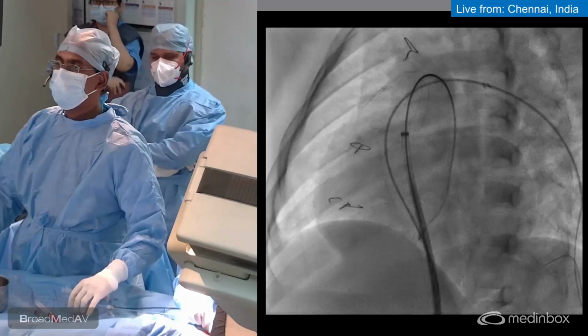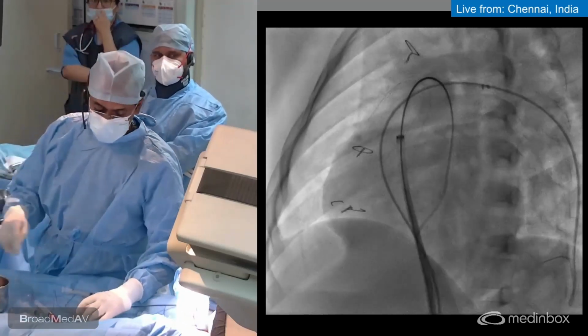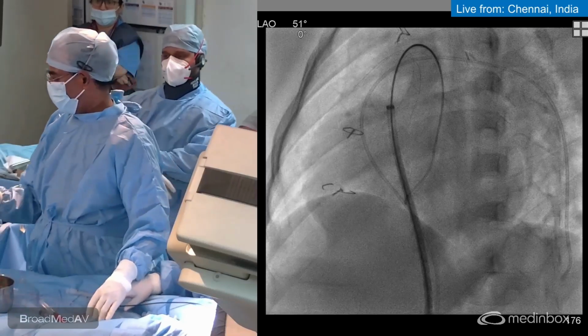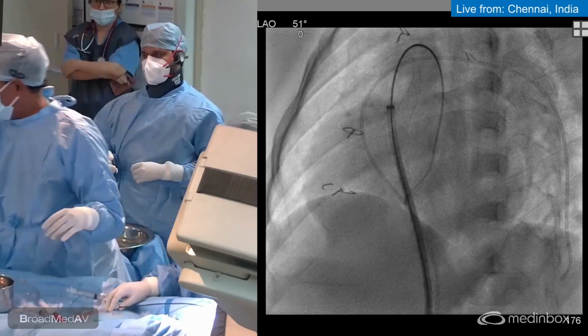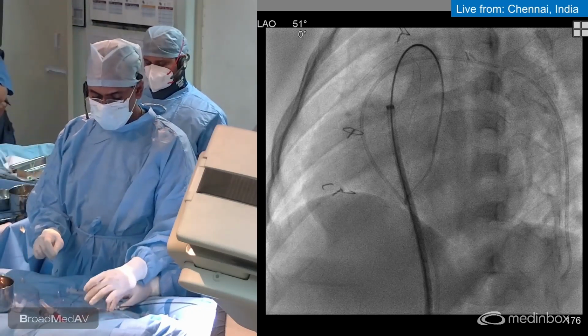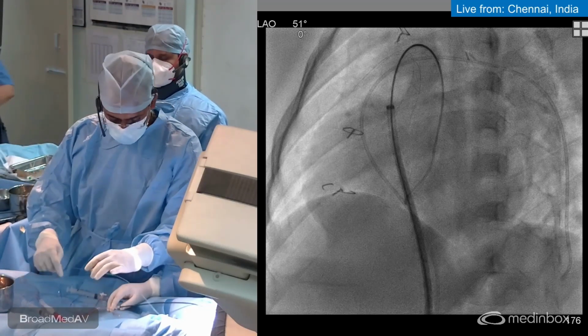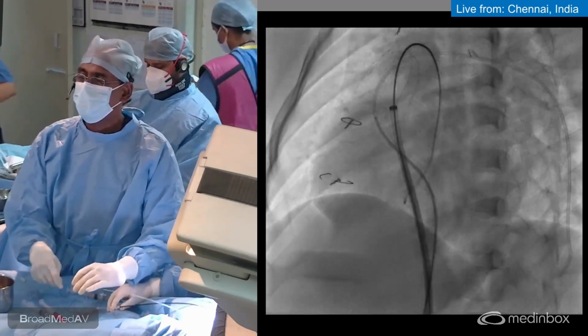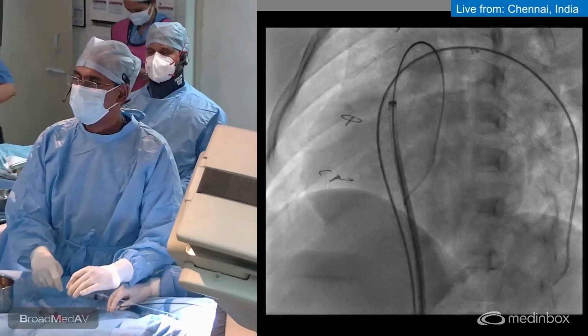The sheaths that you are using are braided sheaths, right, sir? Yeah, in order to prevent any kinks in the pathway, it's a good idea to use a braided sheath, as there are sharp bends from the most anterior main pulmonary trunk to the left and the right pulmonary artery.